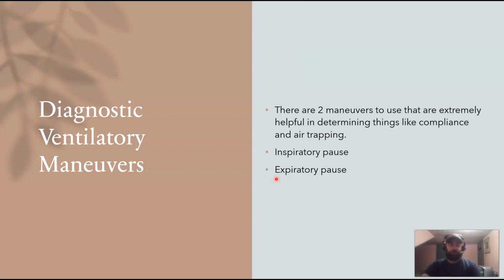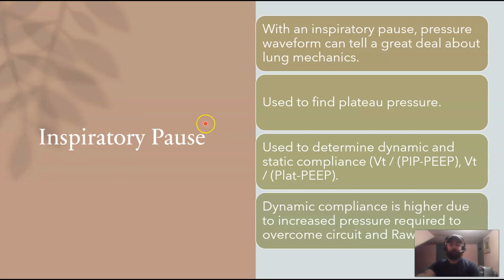So diagnostic ventilatory maneuvers. You have 2 maneuvers here, which help determine things like compliance and air trapping. You have your inspiratory pause and your expiratory pause. So with your inspiratory pause, with this maneuver here, your pressure waveform can tell you a great deal about lung mechanics. We use it to find our plateau pressure. And then your plateau pressure is used to determine dynamic and static compliance.